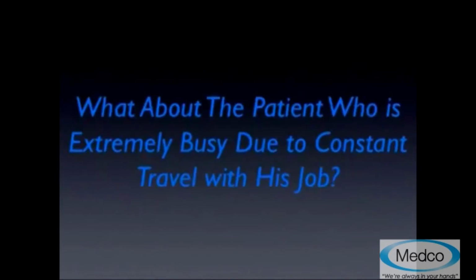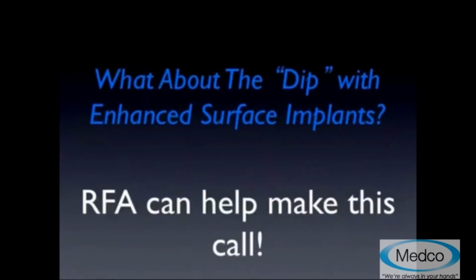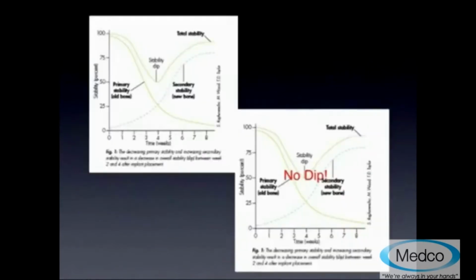So what about the extremely busy patient who's constantly traveling? Well, enhanced surface technologies such as electrowetted surfaces or SL Active are certainly redefining the way we go about implant dentistry, because we've always had to worry about the dip, and I'm going to throw out something today that I think is rather intriguing. Historically, we've looked at implants, and even with the SL Active, we've talked about shortening the dip from 4 weeks' time down to 2 weeks' time, such that at 4 weeks we have a stable implant to provisionalize and load, or even at 3 weeks.